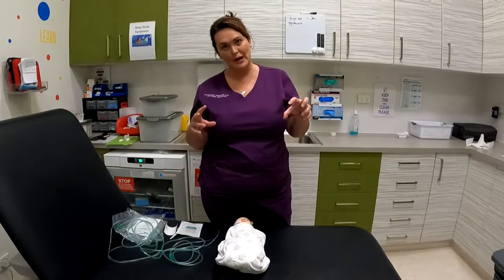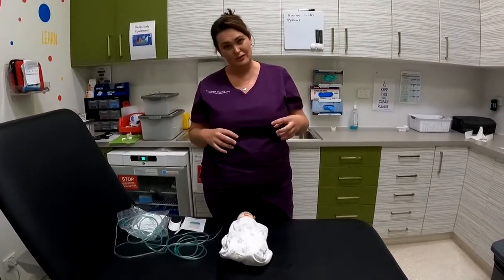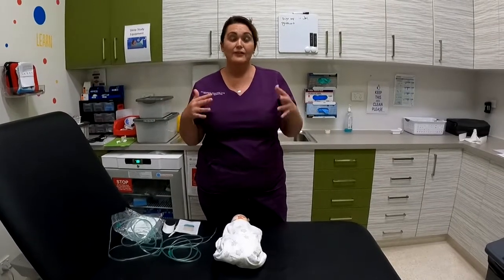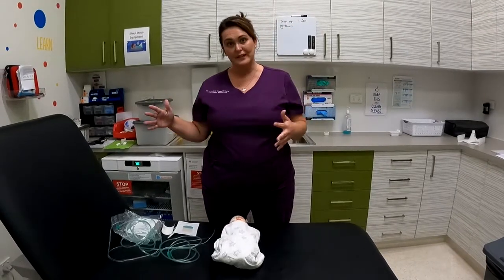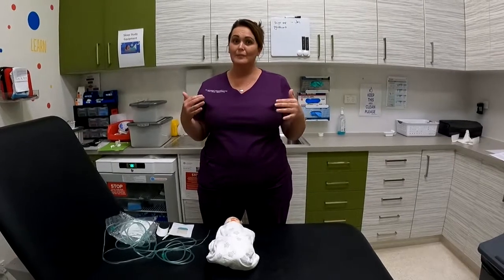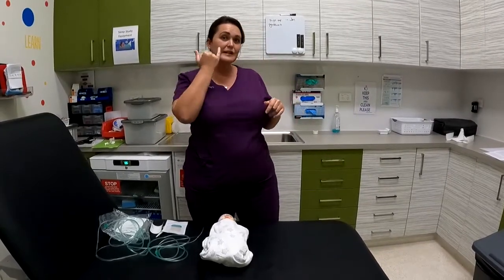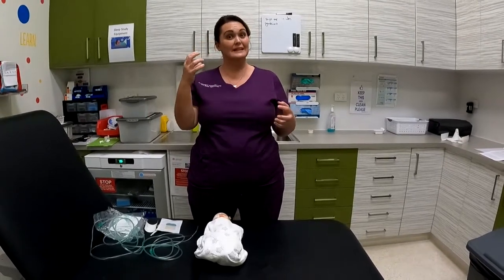The amount of saline spray is a measured dose, so you don't have to worry about giving too much or too little. You have to do this at least 2 times a day, so morning and night. However, if you're finding that your baby has got a few secretions, you can increase this. What you want to do is make sure that those secretions are kept loose, because where babies get into trouble is when the secretions become thick and it makes it difficult for them to clear. And this happens right in the back of the nasopharyngeal passage where you can't really see it.